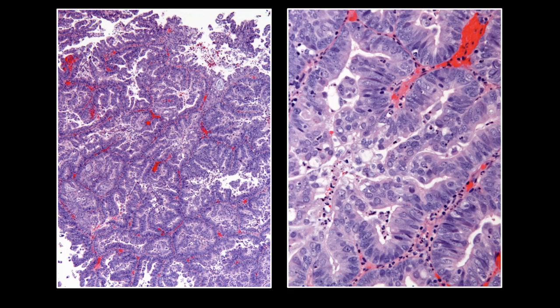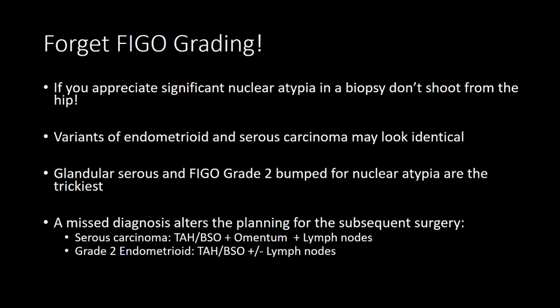And so what I'm going to say now, I hope that some of my GynPath friends out there are not listening too closely, or maybe they haven't had their coffee yet. But what I'm going to tell everybody now is that when you see a biopsy like this, you have to forget FIGO grading. And now, please don't quote me on that.